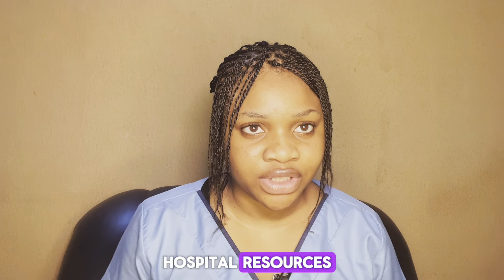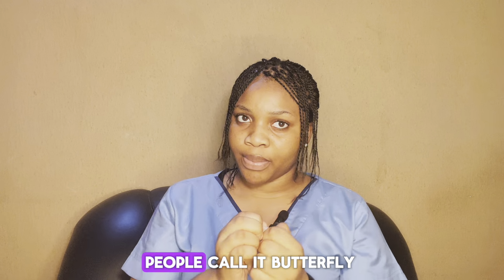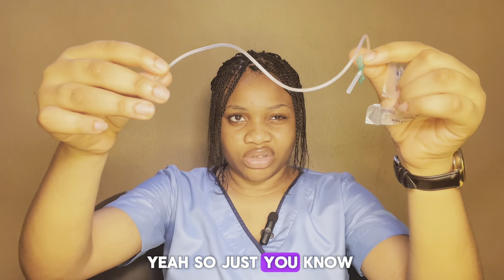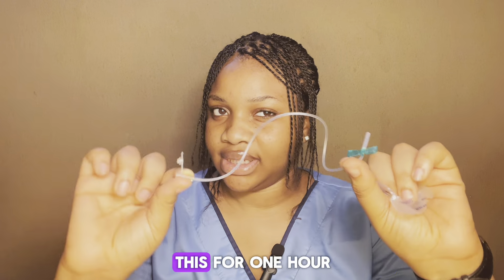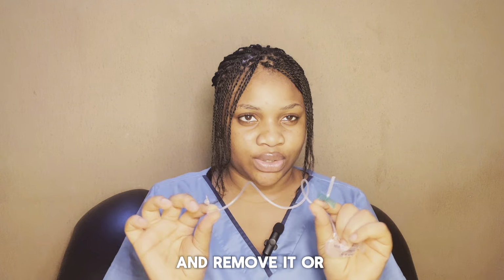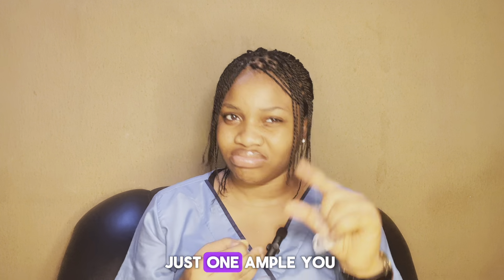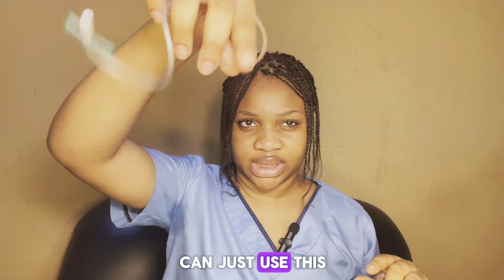This is called scalp vein. Some people call it butterfly. It's called scalp vein. So if you don't want to wait, you can just use this. In 1 hour you can remove it. Or there are some people that will just come for IV medication, just one ampoule. You can just use this.